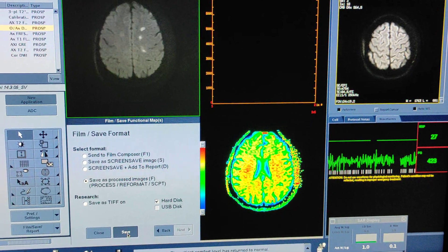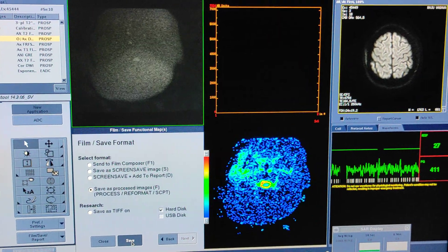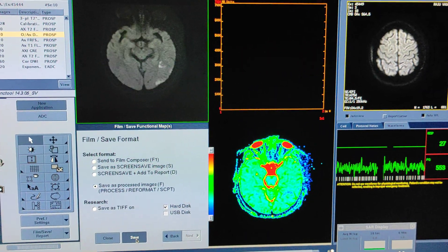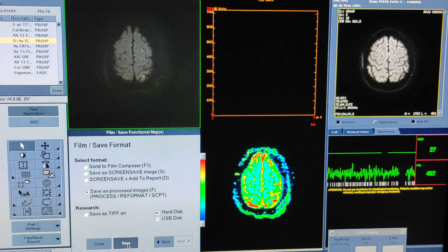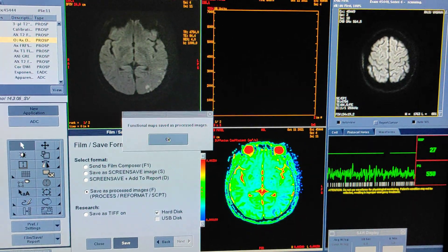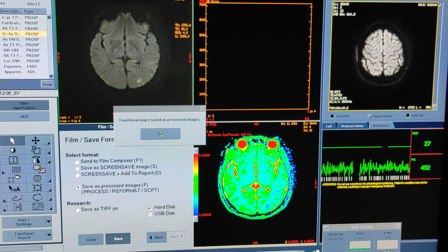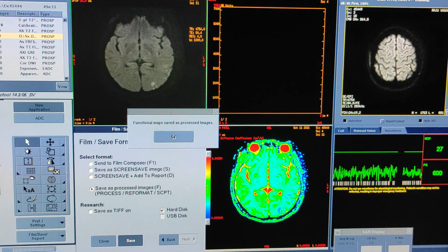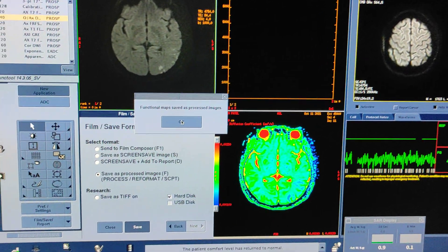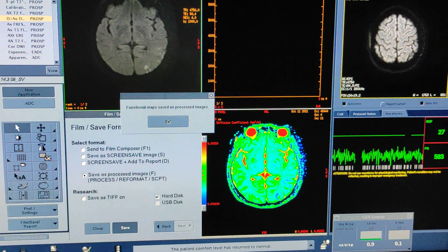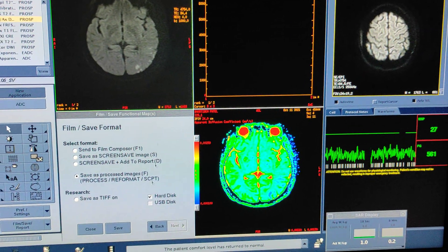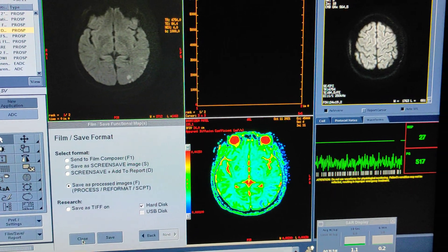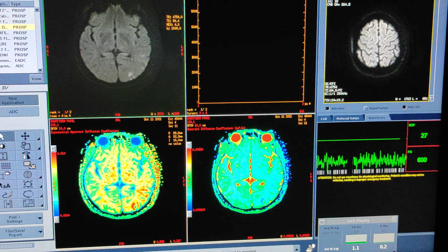In only a few steps you can create an ADC — it is very easy. Whenever you are seeing an acute infarct, it is a must to create an ADC to check whether it is a recent ischemia or a subacute.